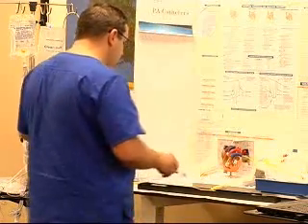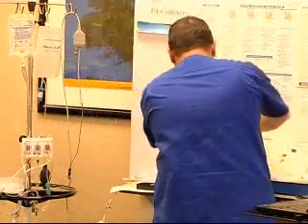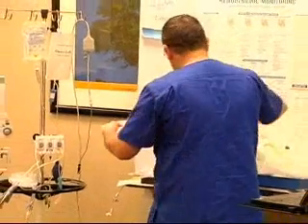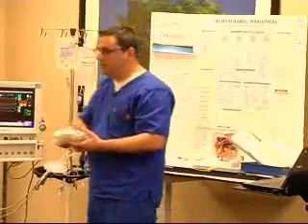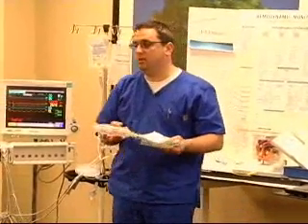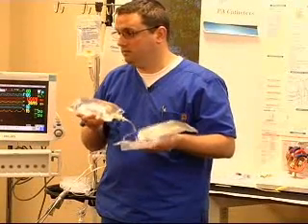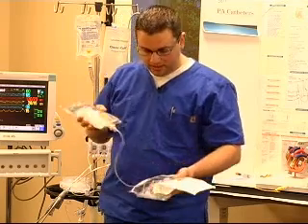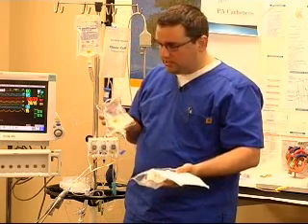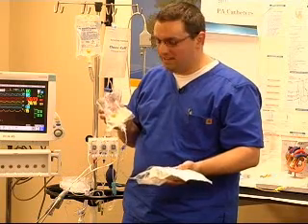So to satisfy your physician for their first set of numbers, and anytime you're shooting numbers, which, by the way, is standard of practice with a PA catheter in the critical care setting, you do cardiac outputs with these every 4 hours. So making sure that we're keeping up with that. This is the cardiac output set. It doesn't come with a bag on it already. I already had this bag, but it would leak everywhere, so I didn't pull it out.